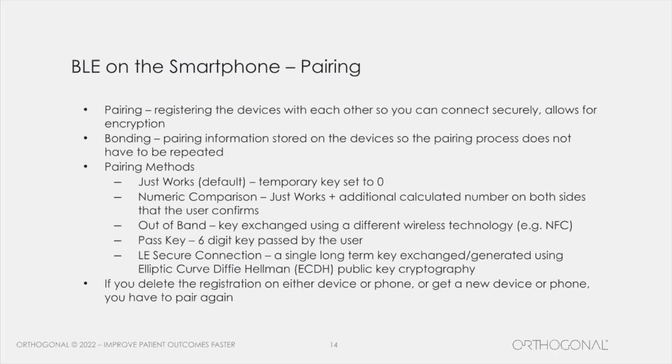Passkeys and LE Secure Connections. These are things we're going to get into a lot more in a future webinar where we talk about cybersecurity. Another thing to think about here is that if you delete the registration, either the device or the phone, or you get a new device or a phone, you're going to have to pair again.